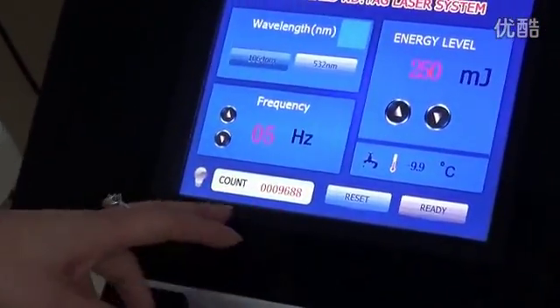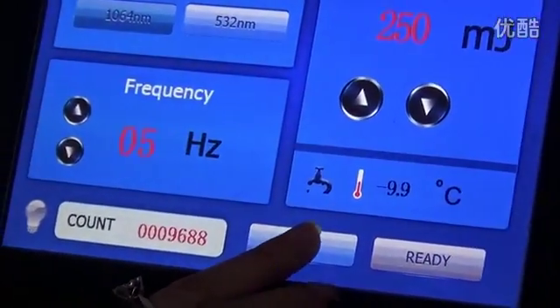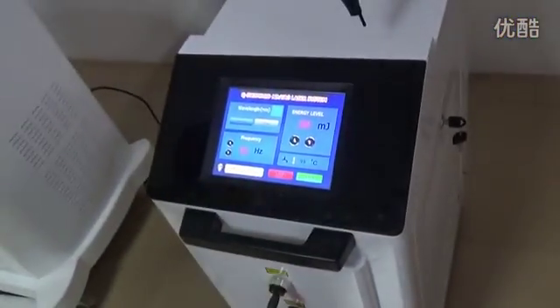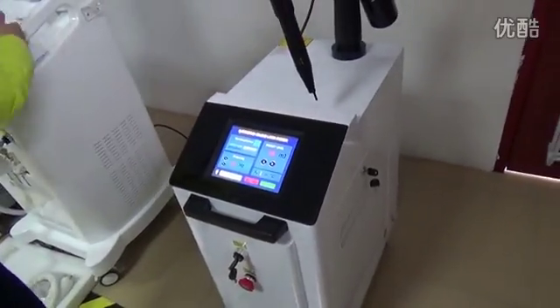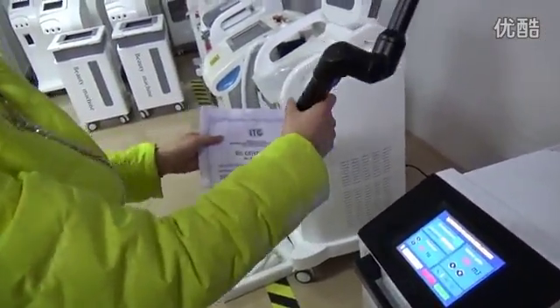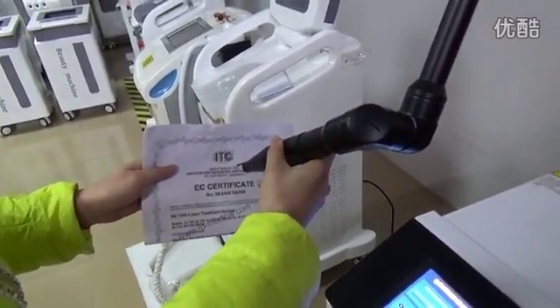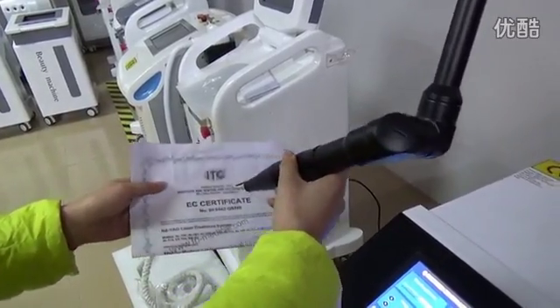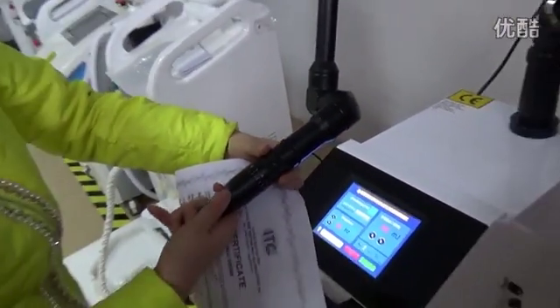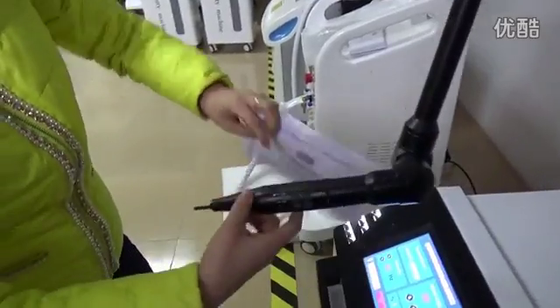After setting the correct parameters, press reset. Then press ready. Now press the foot switch, and you can adjust the head.